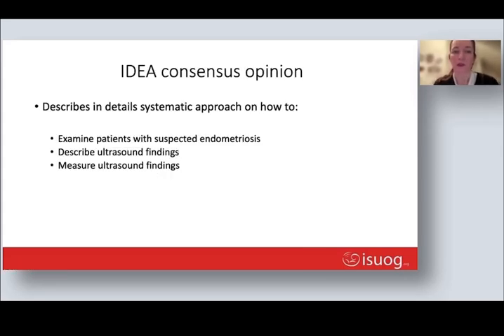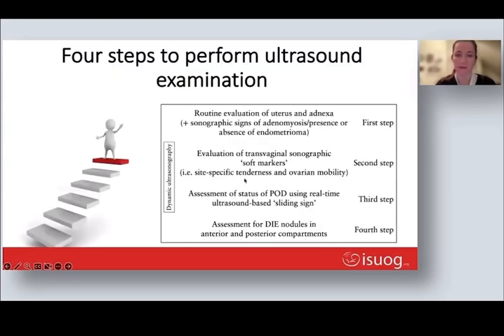IDEA consensus opinions describe in detail a systematic approach on how to examine patients with suspected endometriosis, how to describe ultrasound findings, and how to measure ultrasound findings. There are 4 steps recommended in performing ultrasound examination according to the IDEA consensus opinion.